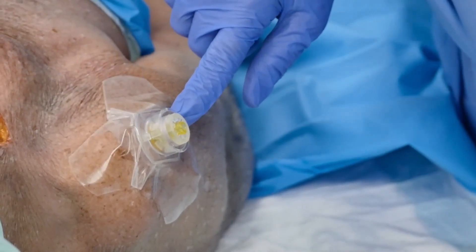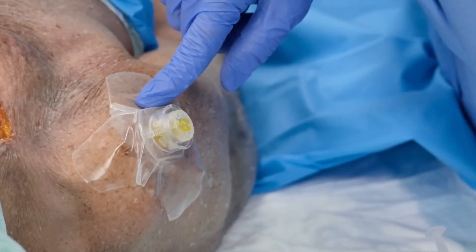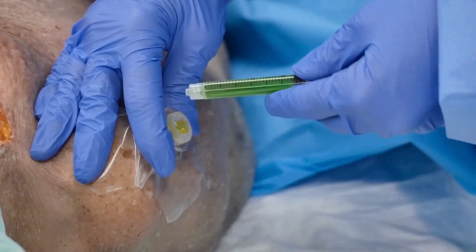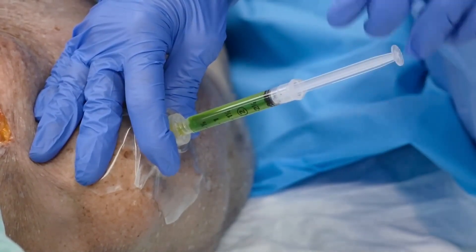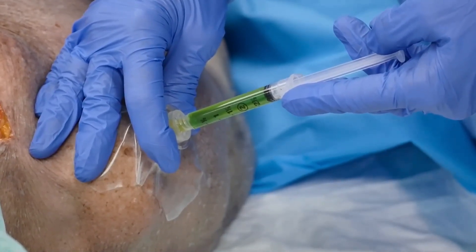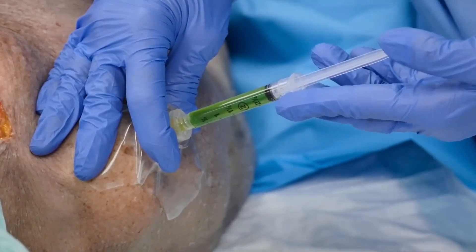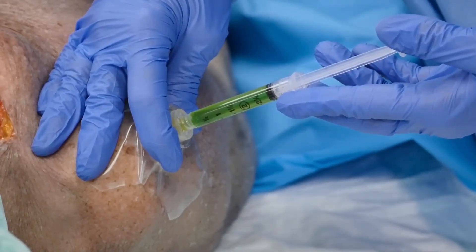We just placed this proximal humerus IO — a yellow 45-millimeter needle set. This patient we're going to assume is either fully alert or alert to pain, so we're going to infuse two percent preservative-free and epinephrine-free lidocaine. We have three mLs right now, which is 60 milligrams, and we're going to infuse that over two divided doses.